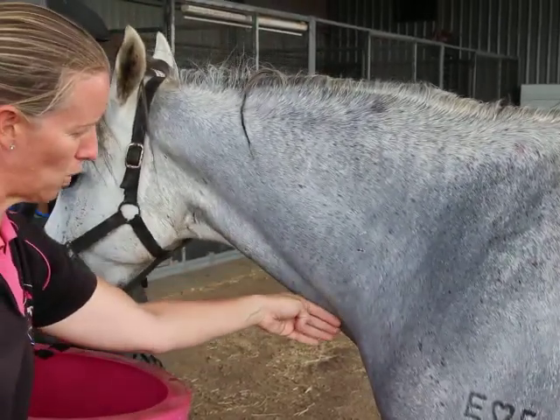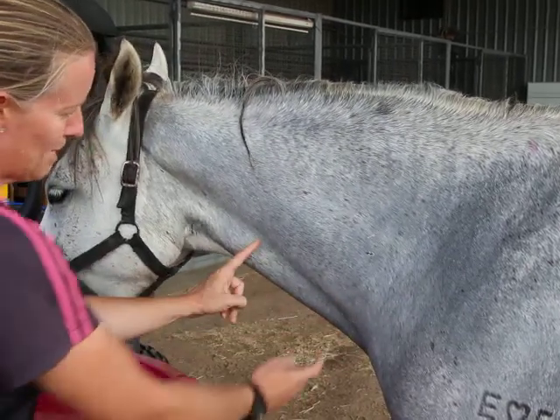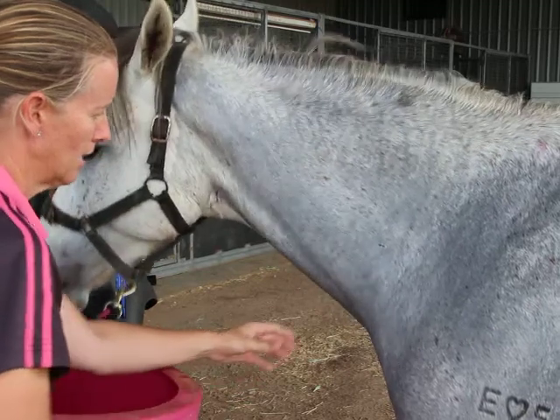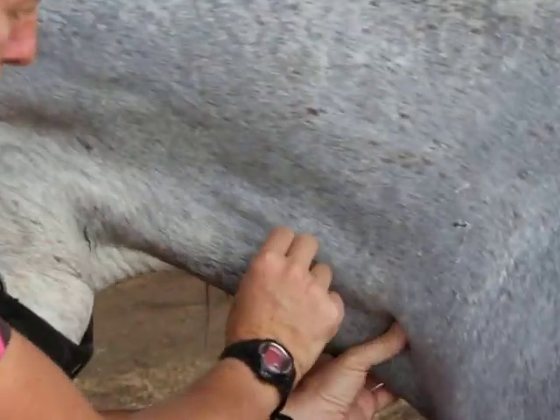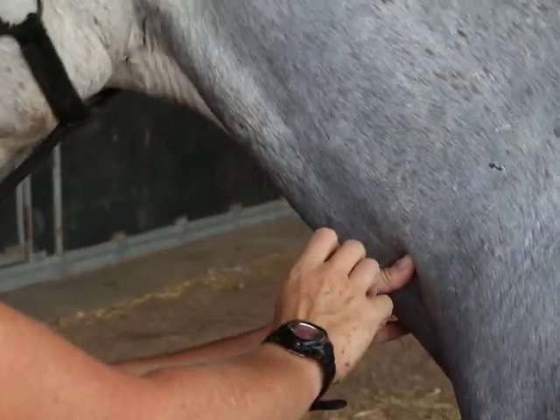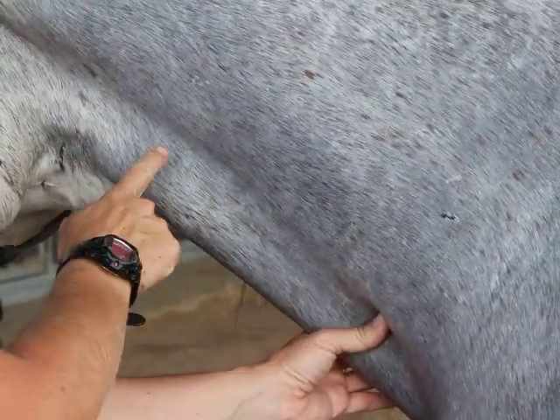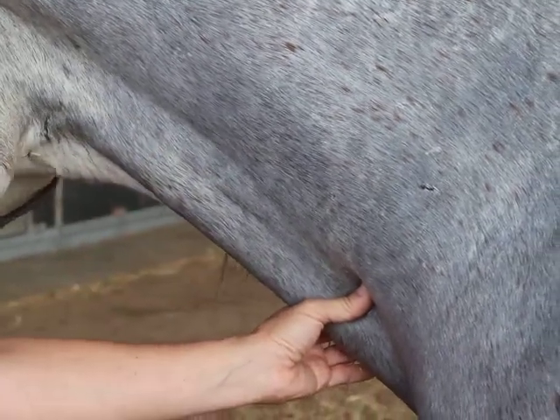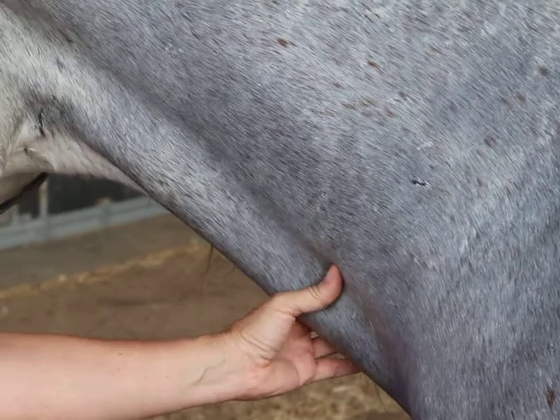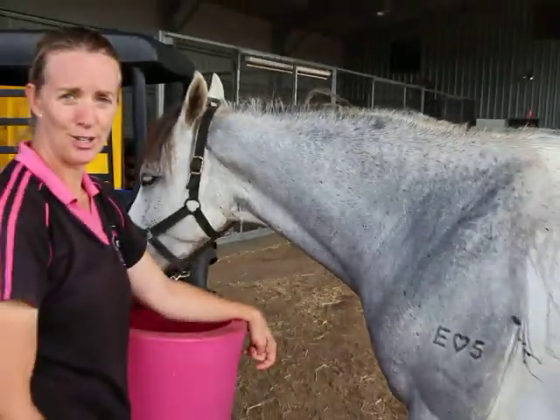If you do the bottom third, it dives down quite central and midline and it's hard to get to, so the middle third is the best way to inject. You need to occlude the vessel, make it rise up, pop your needle in, draw back to make sure you're still in the vein, and then inject. That's the jugular groove with the jugular vein — it raises up and drops down. That's your intravenous injection site. Thank you.